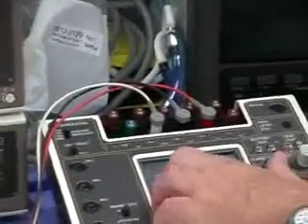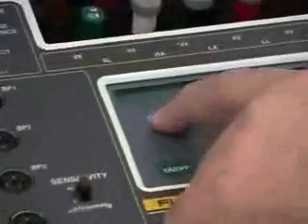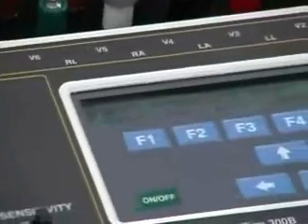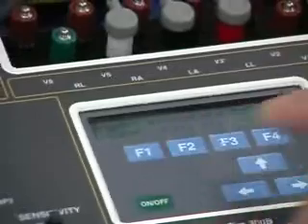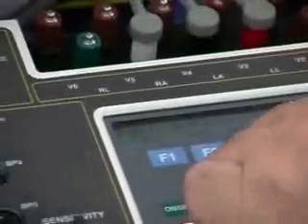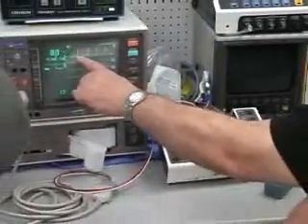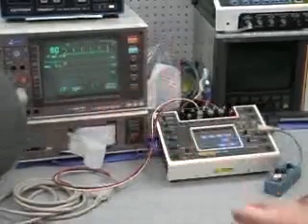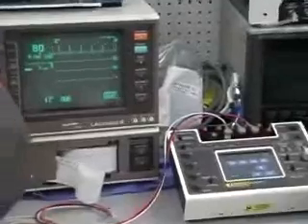And we can insert a single shot PVC, premature ventricular beat, just by a push of a button. Just one? Yeah. And also a premature atrial contraction, so it's just a normal one that's a little bit premature. And then a nodal rhythm, which gives you a reversed P wave, but again a premature beat from a little lower in the heart at the AV level.